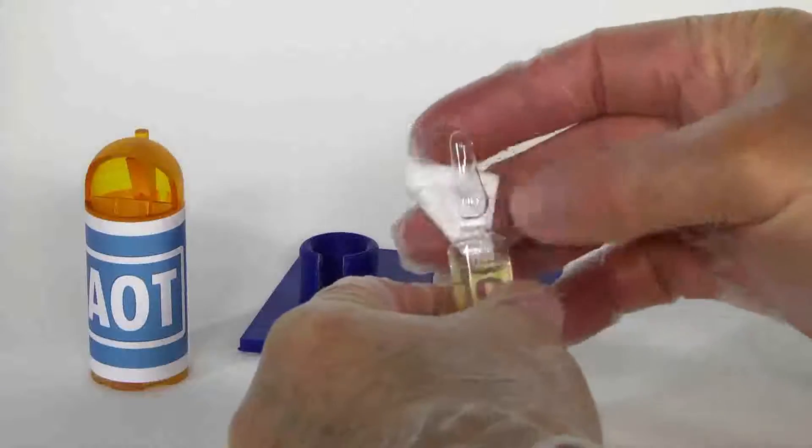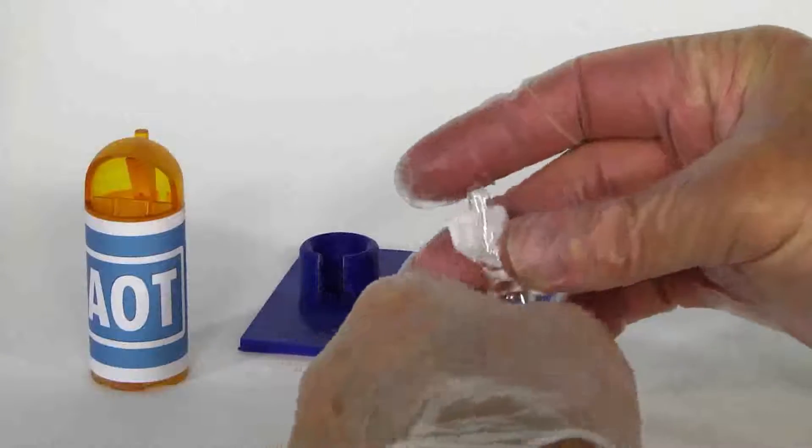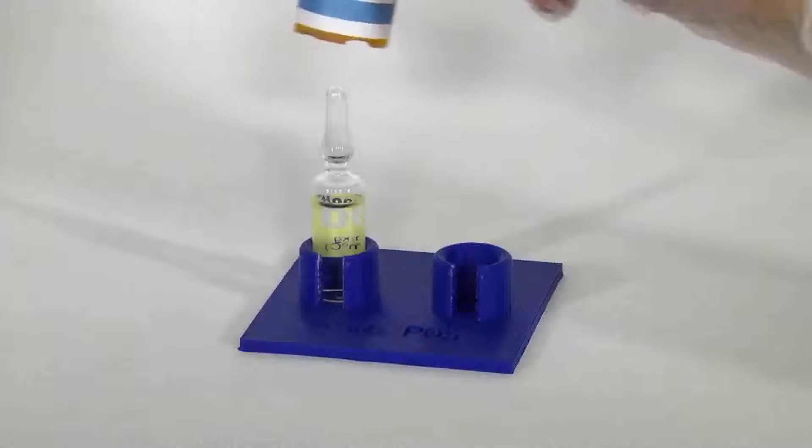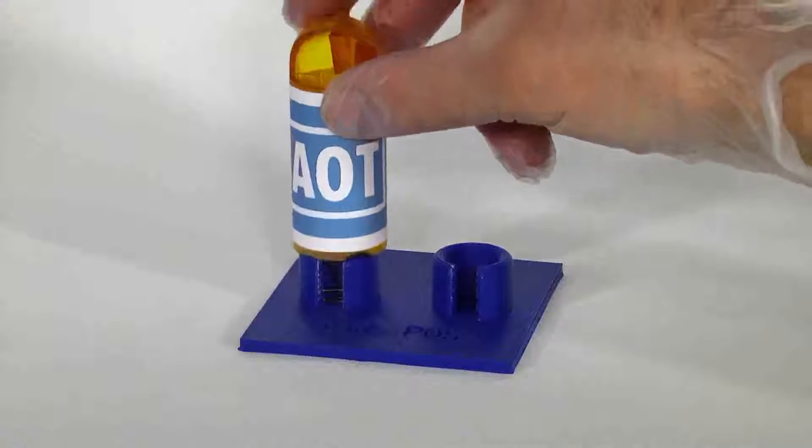If it is sized correctly, then clean your ampule and place it in the base. Slide AOT opener over and down on the ampule until there is a slight resistance felt.